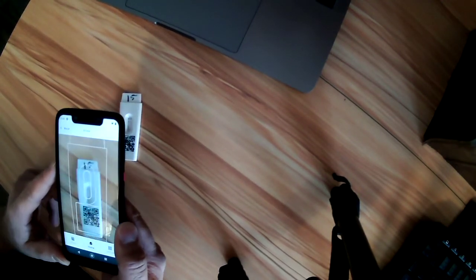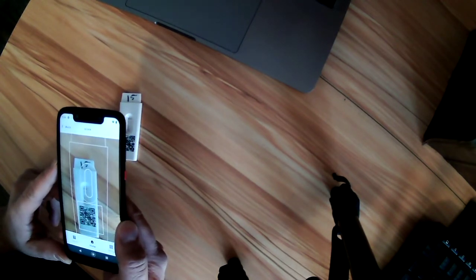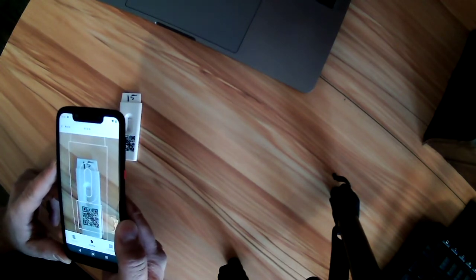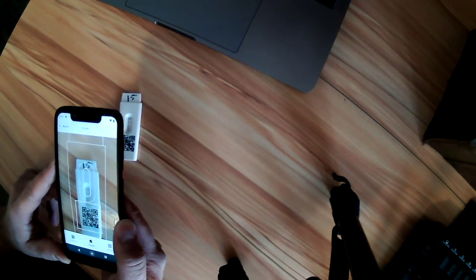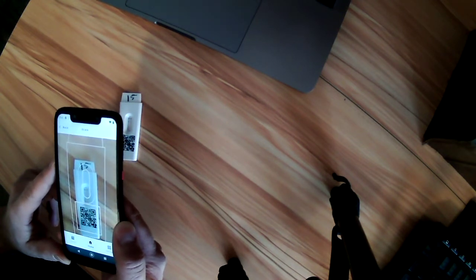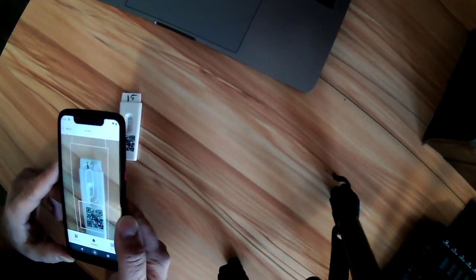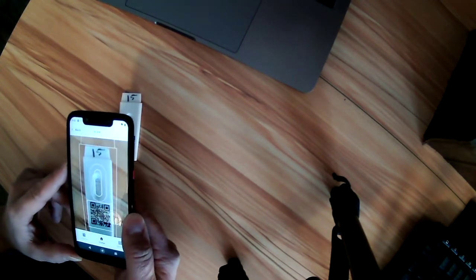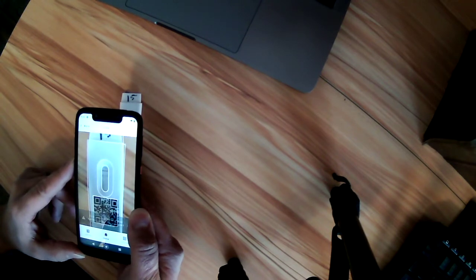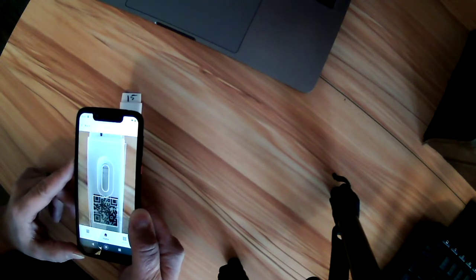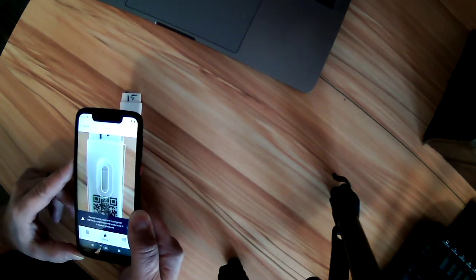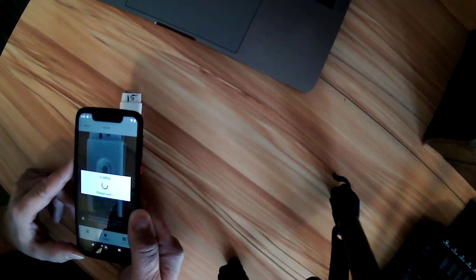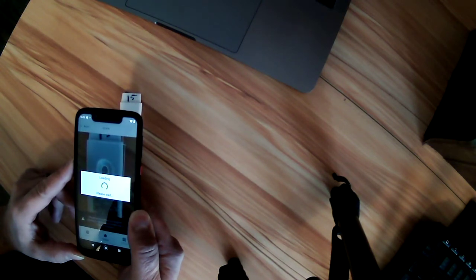As long as all that criteria is met, the way that I like to do it is to just start so that the QR code is in the box but it's smaller, so the phone is farther away, and then just slowly go into the test. You'll notice here we're getting that banner in the bottom, but we were able to overcome it just by the phone focusing.